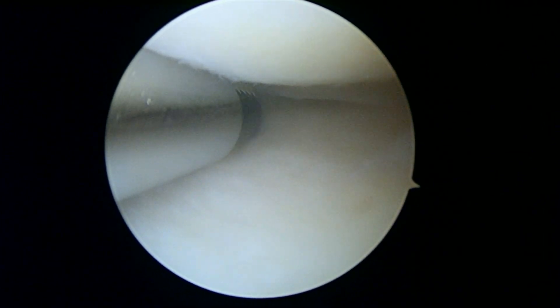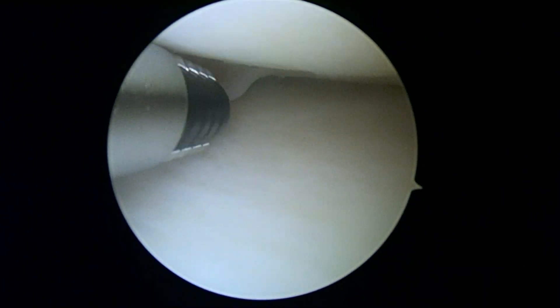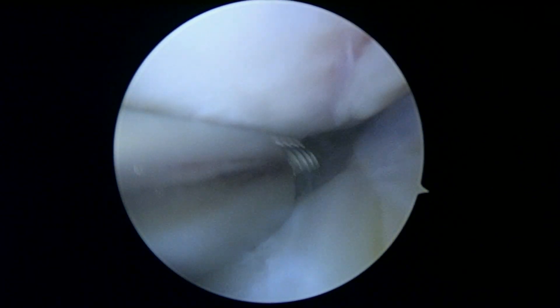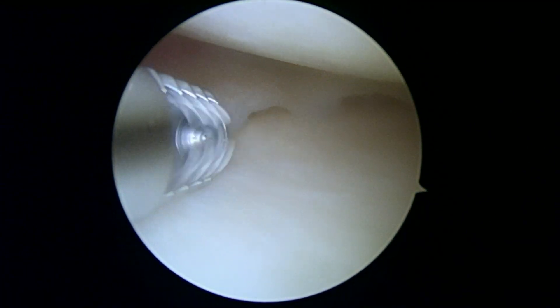It extends to the undersurface and right now we're just irrigating the knee with some salt water, but the tear is right basically straight back around pointing. We'll open that up a little bit and decide if we have to do anything to that in a minute.